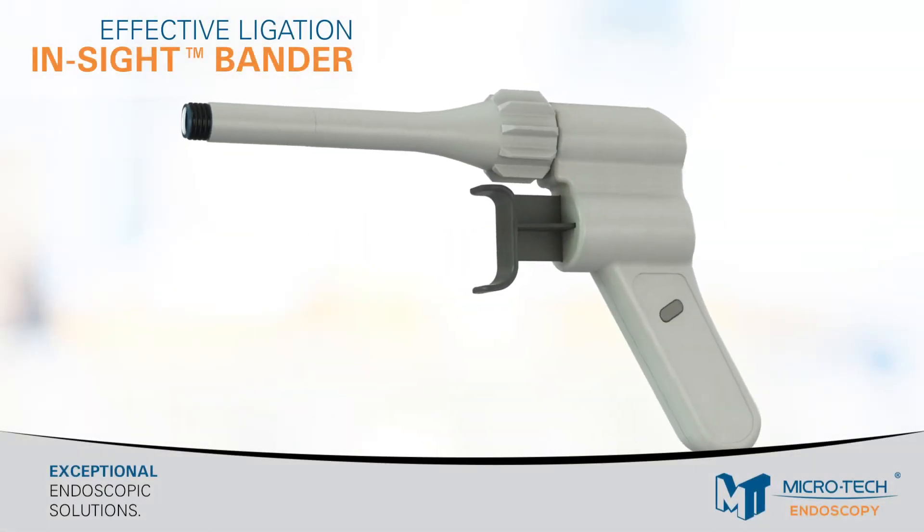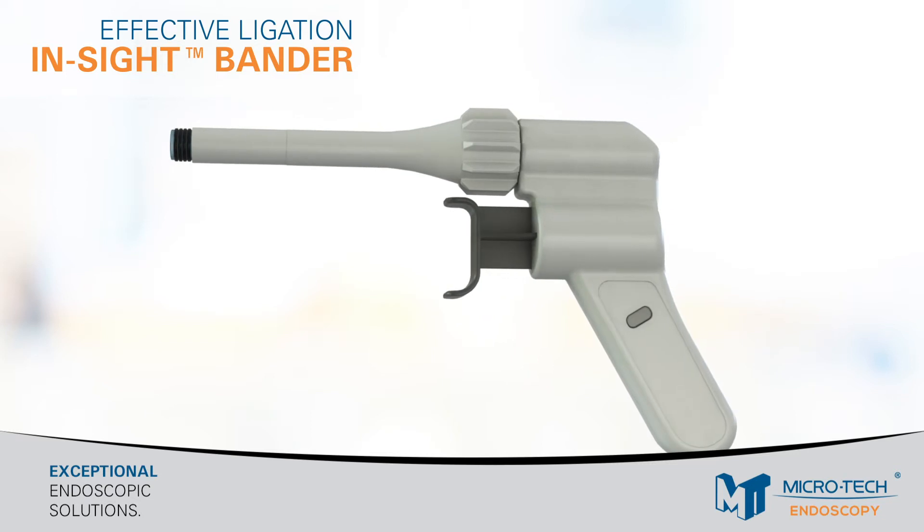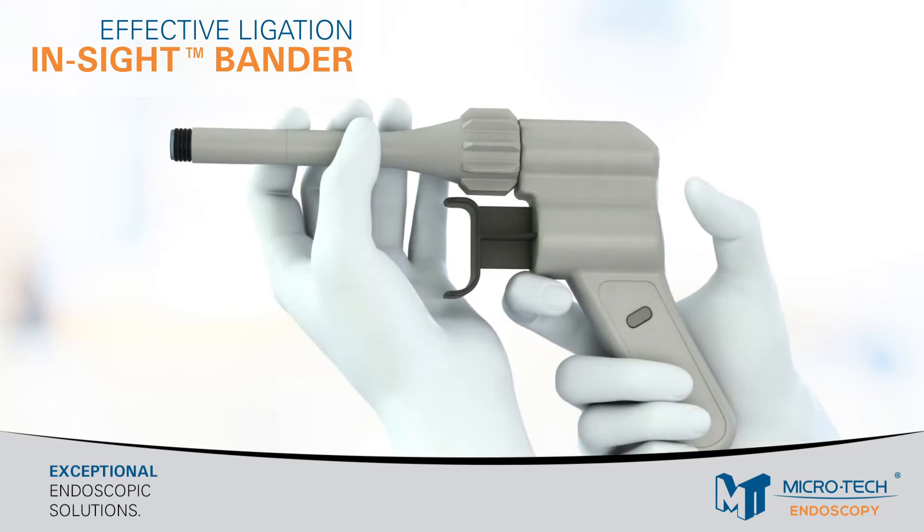The new Insight Ligator is manufactured and distributed by Microtech Endoscopy. It is the only ligator with an incorporated light and allows banding under direct visualization.